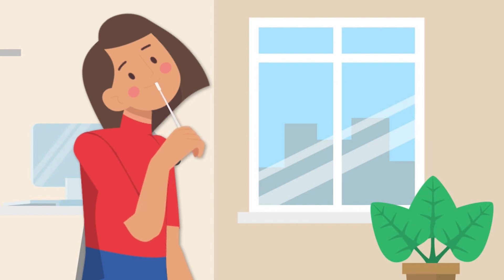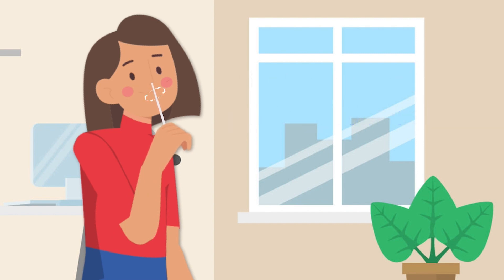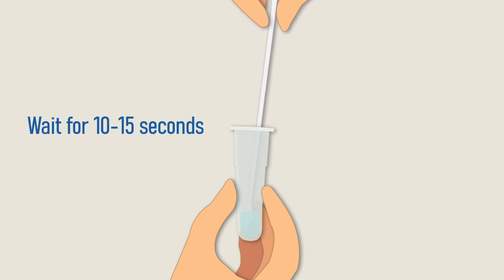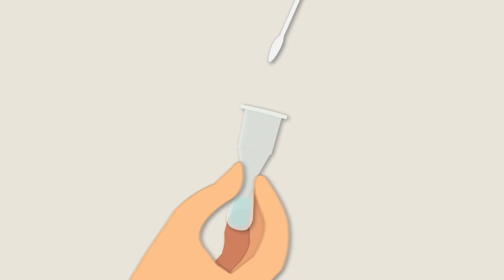Wait a few seconds and repeat the same process for your other nostril. Place the swab into the extraction tube, turn it and leave it for 10 or 15 seconds. While removing the swab, pinch the tube with your finger to leave as much solution as possible in the tube, then close the tube cover.